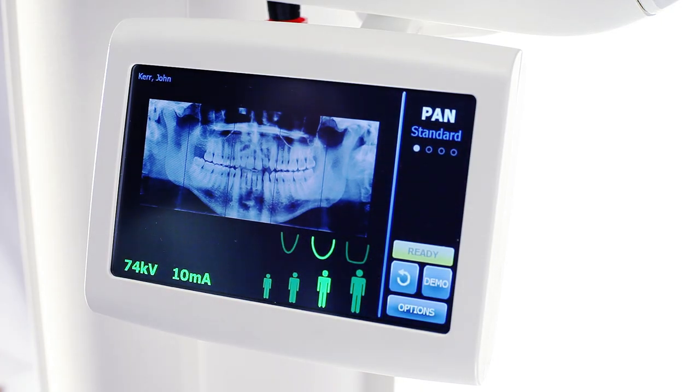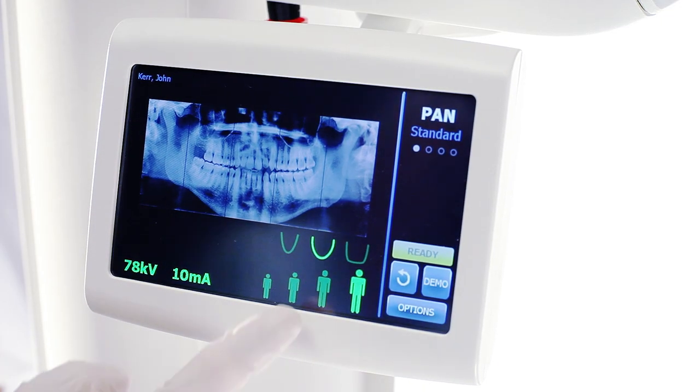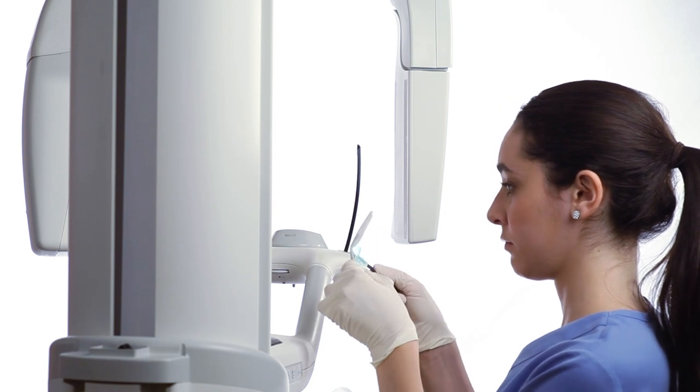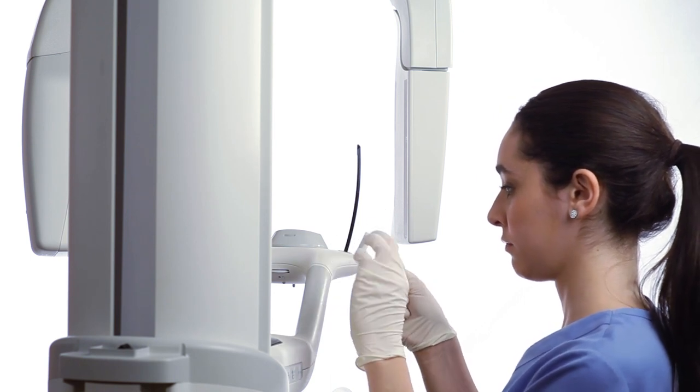Verify your technique according to the patient's size and anatomy. Explain the examination process to the patient.